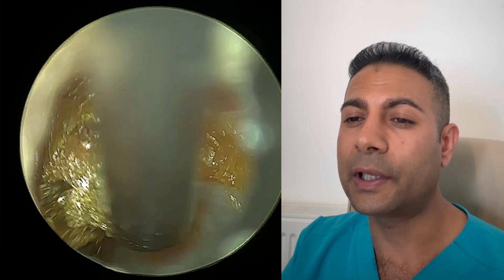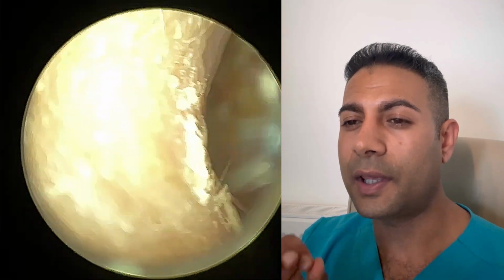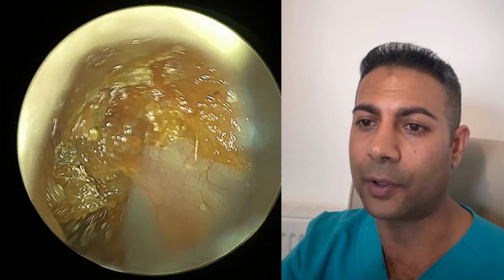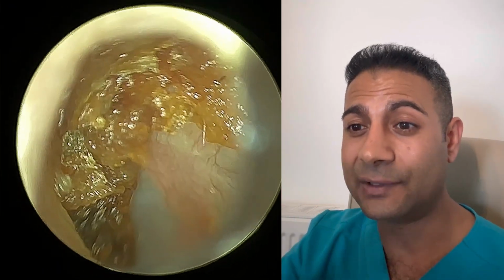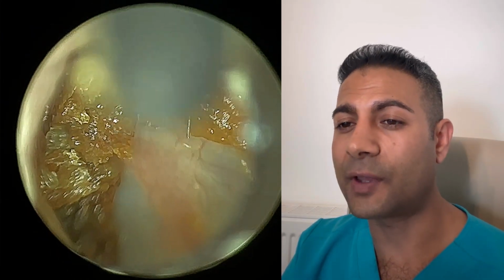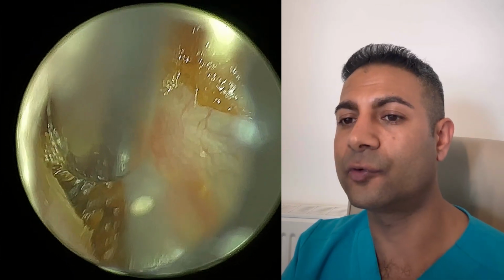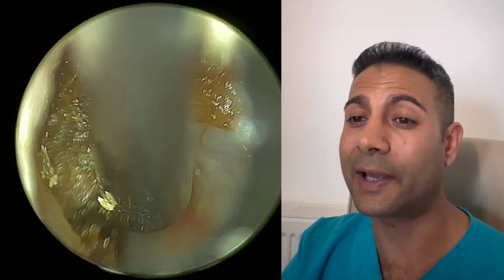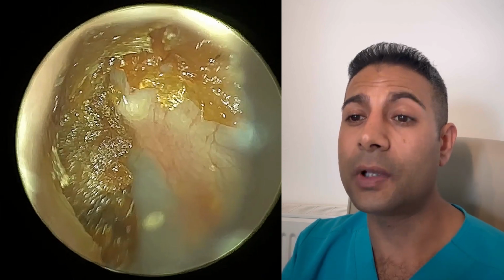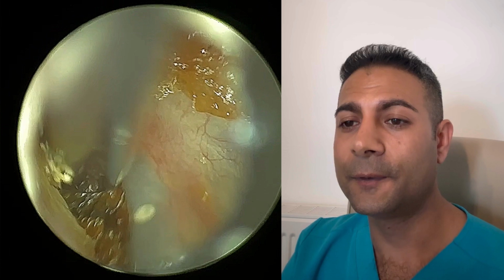So I'm just working at the roof of this patient's eardrum and ear canal. We can't yet see the short process of the malleus. So we can see the hammer bone, the manubrium. This is the handle of the malleus. And at the top of the handle, there's a little sphere, and you can call that the lateral process or the short process. So that's still smothered with wax. Again, I'm just entering. The short process is now revealed.